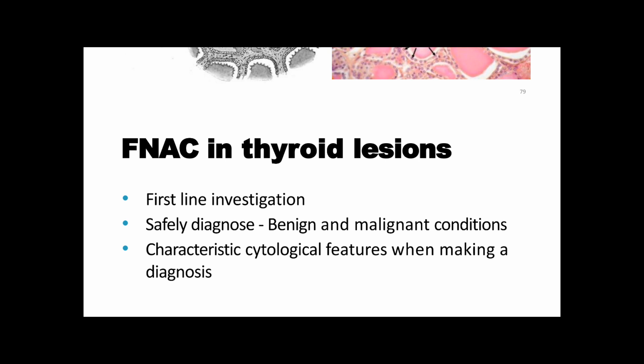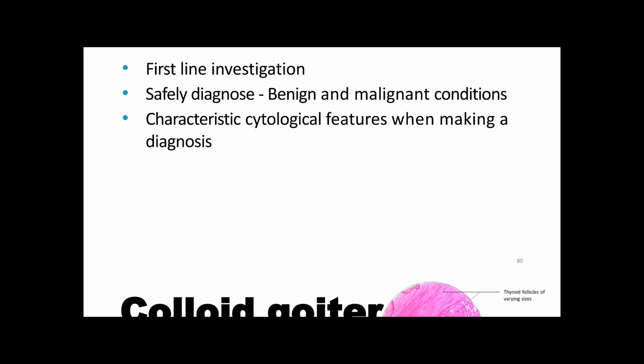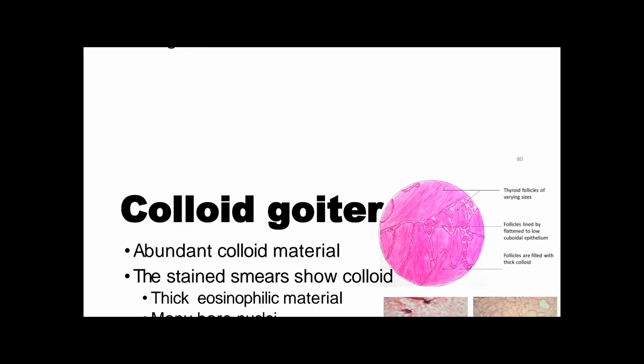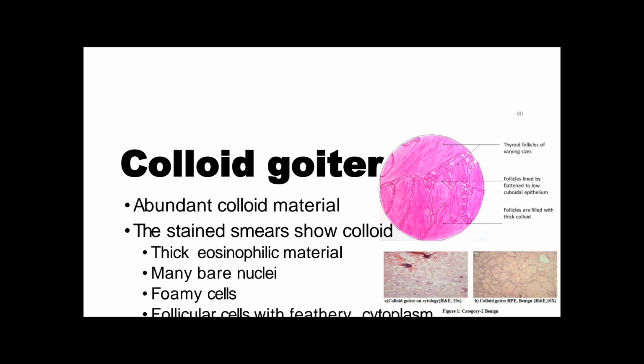Benign and malignant conditions of the thyroid gland can be safely diagnosed by the FNAC technique on many occasions. So these characteristic cytological features are taken into consideration when making a diagnosis.